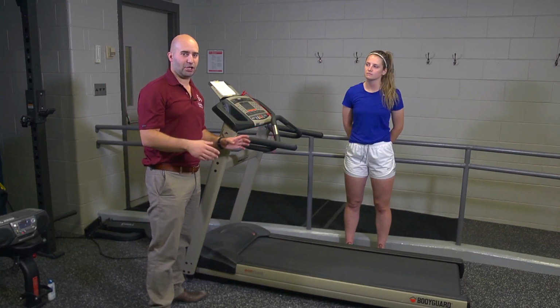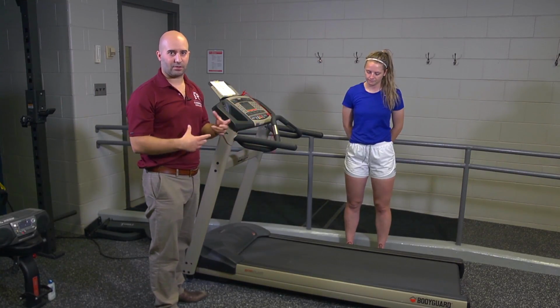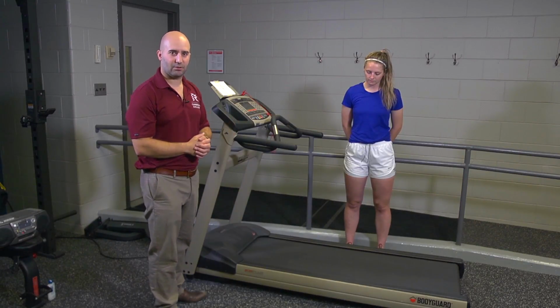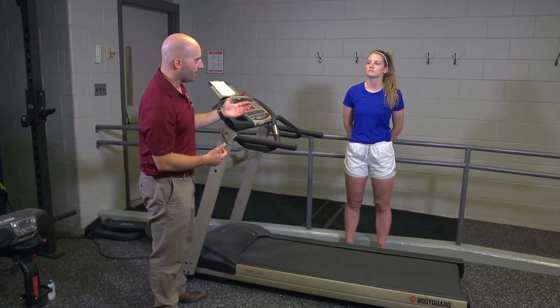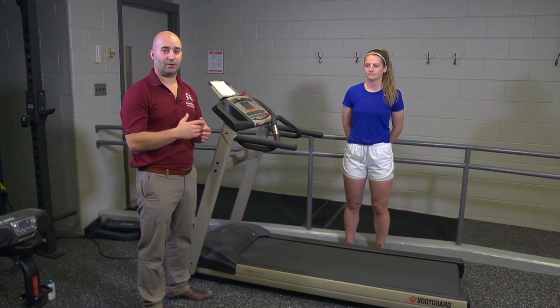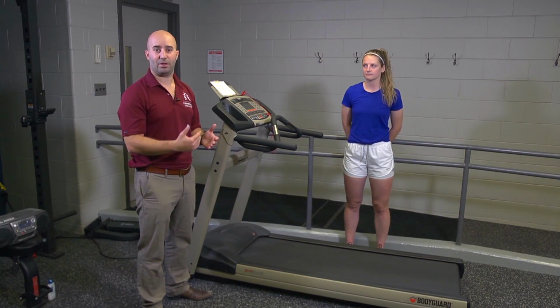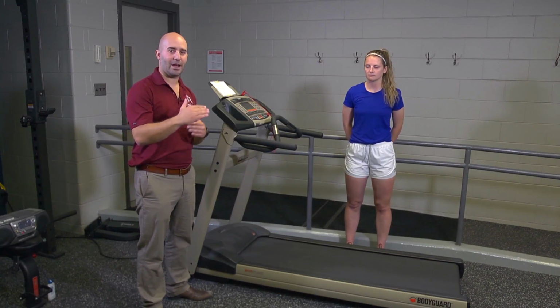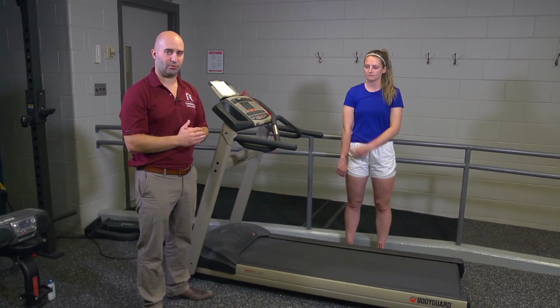Now, I'm going to be using my judgment based on basically my client's athletic profile, the past, how active they are currently. So the screening questions I would have asked in advance. Clara being a varsity athlete, I know she's quite active and quite fit. I'll put her more probably closer to the 4 miles an hour mark, maybe 3.8. And then from there, after the second minute of the test, I might have to adjust it to get her in the range I'm looking for.